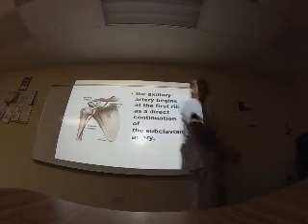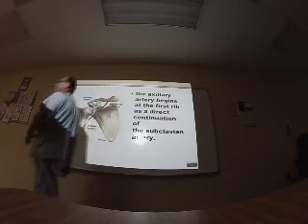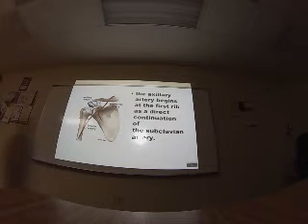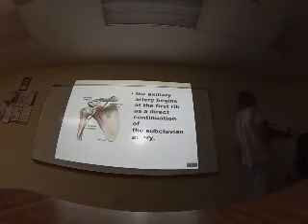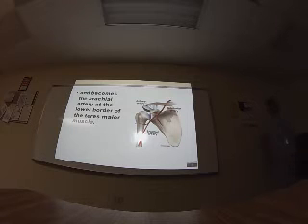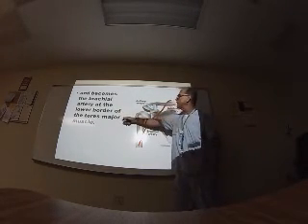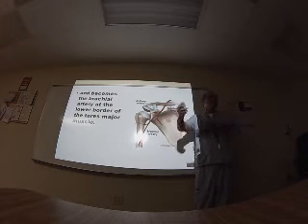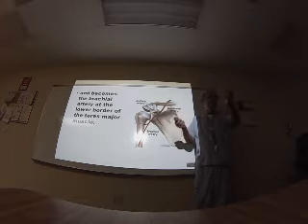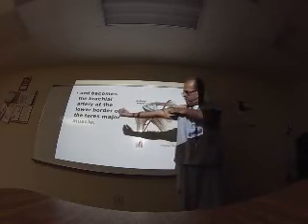Very easy to scan. Very easy. Only put the transducer in the axilla, and you can find the axillary artery. It's a big artery, and the artery and the vein are together. Artery and vein are together in the axilla and become the brachial artery. After the axilla, when it goes through the border of the teres major, that is something you cannot see in ultrasound, because you cannot really see the moment when the brachial artery begins, but you know how to scan the brachial artery. I explain you. You can see the difference.